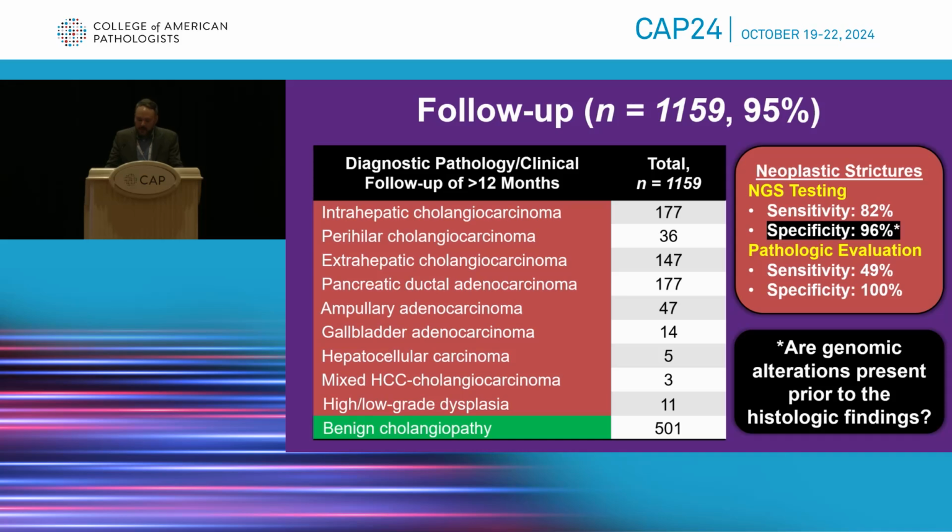And this raises a question with a lot of these more highly sensitive methods of NGS testing or sequencing analysis, where you detect alterations that may be way before the follow-up period where the patient develops something concerning, or potentially they have something that is concerning and it goes away at some point and never becomes a problem.